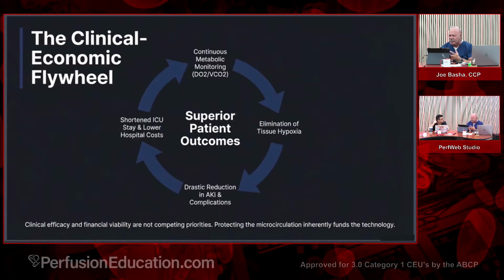I think aggressive use of ultrafiltration when needed is very beneficial. I feel that using CVVH on bypass for the removal of pro-inflammatory mediators is critically important. It should be done more commonly, using the right fluid to do that, vis-a-vis Duosol or Prismasate or the next stage fluid. There are so many of them out there, and tailoring which fluid you're going to use for your particular patient.